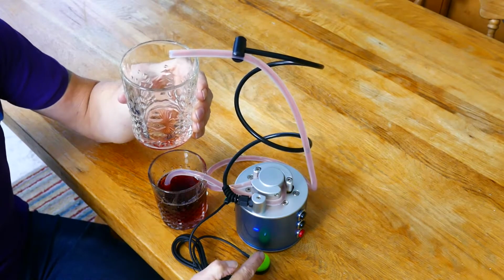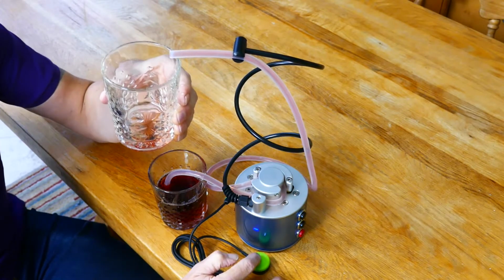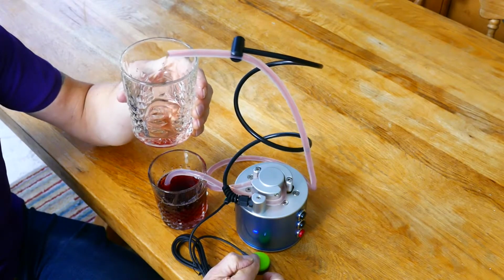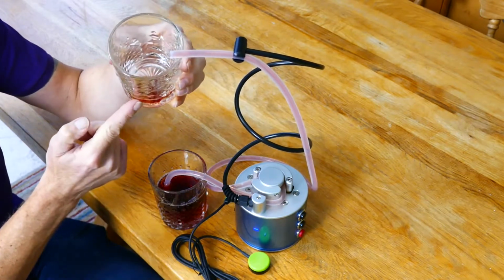And then if I press it, you'll hear a beep noise, and that'll tell me that I can't drink again until I've released the button, and it gives you time to swallow safely. As you can see, the amount is quite small.